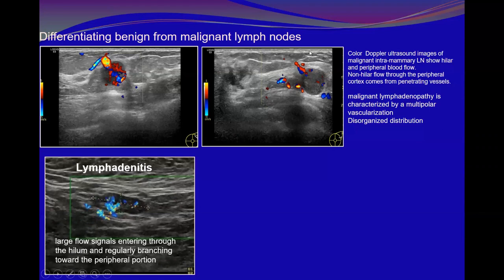Okay, and even look for the vascularity here of the lymph nodes. Here it is disorganized. Though the majority of the vascularity is coming from the hilum, it seemed to be disorganized. And as we mentioned, if we compare it with this one, this is also my patient. But look, yes, hypervascular, but the vascularity coming from the hilum then extends toward the cortex.